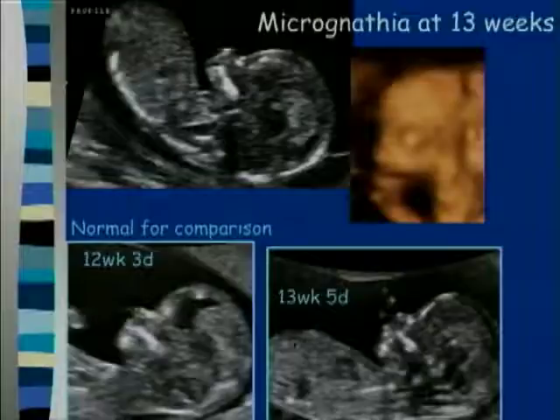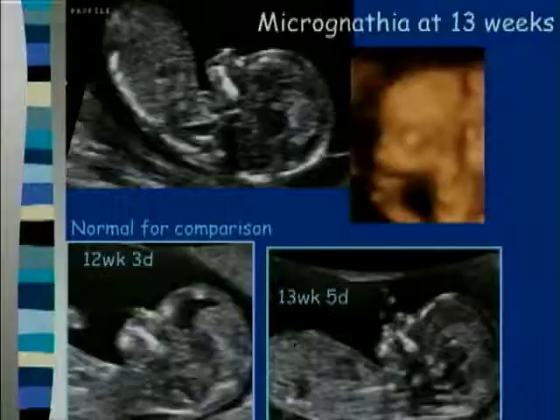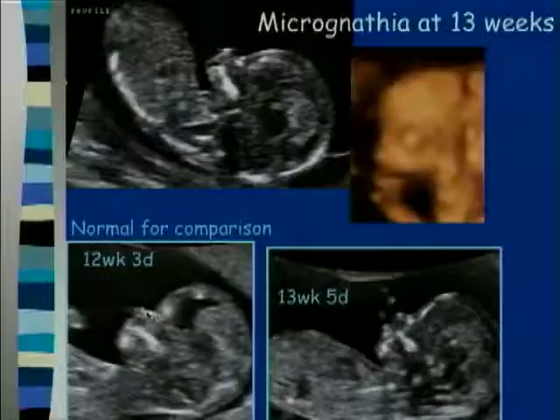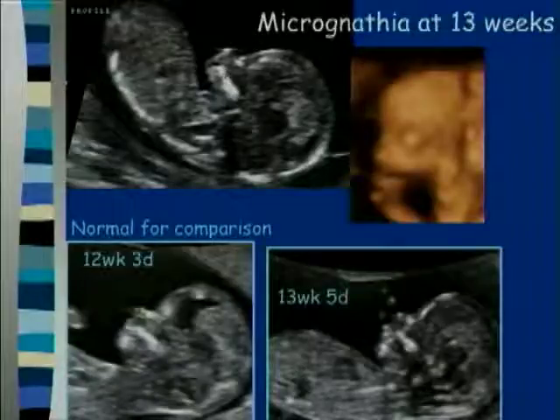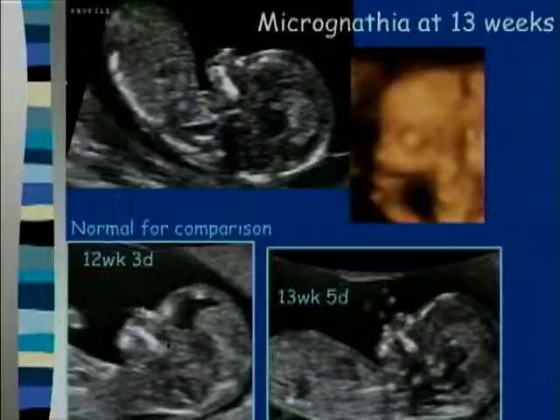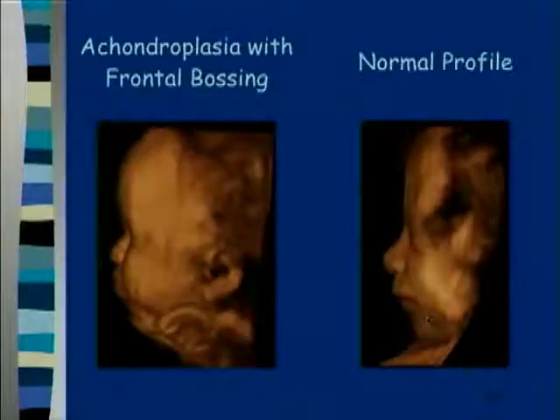Now, when this case came through our fetal conference saying that one of my colleagues had called micrognathia at 13 weeks, I was just blown away. But when I looked at the pictures, I go, well, yeah, for sure. Look, here's a normal profile at 12 weeks, which we do on all of our NT patients, and here's the nasal bone that they're looking for, and notice the mandible versus the maxilla, and in our case, you can see that there's a maxilla, but there's really no mandible. So this fetus did have micrognathia at 13 weeks, and I just have another one at 13 and 5, and this is 12 and 3, just to show you what a normal should look like in comparison.